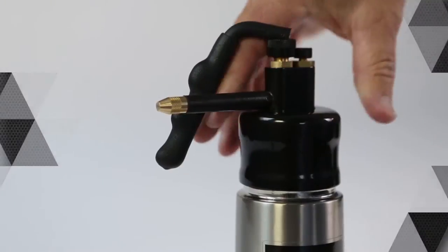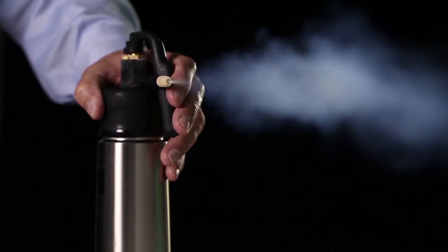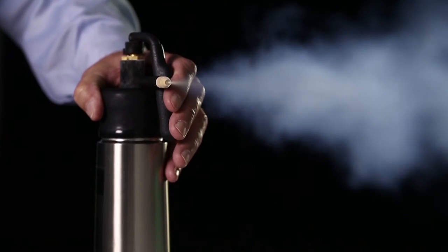Keep the flask in an upright position and firmly screw the turret onto the brass flask top. The flask will self-pressurise and will be ready to use in 60 seconds. The flask may be topped up at any time.